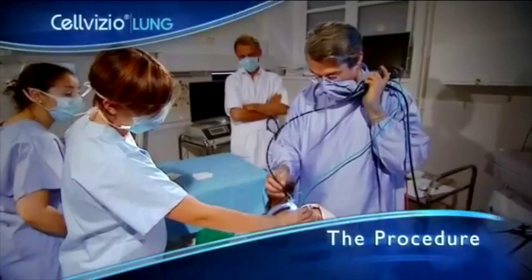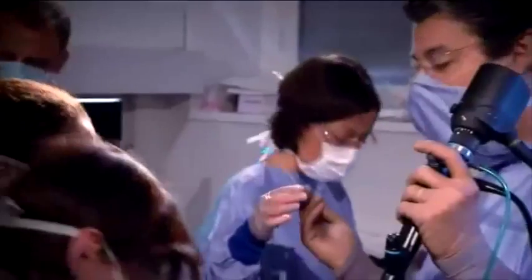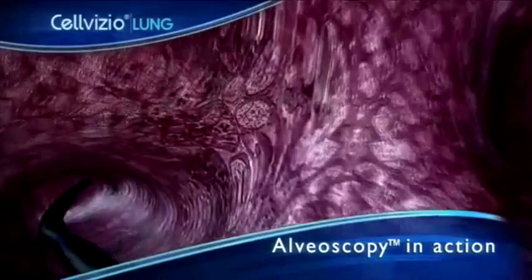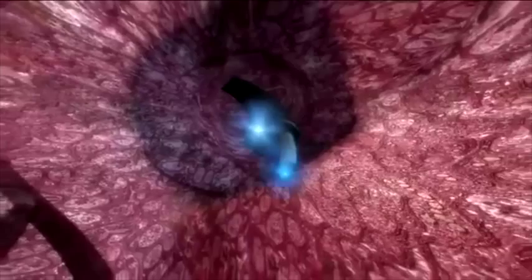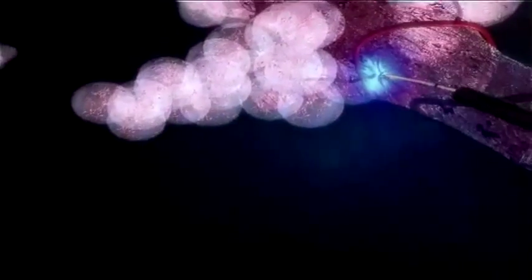The physician performs a standard endoscopy procedure. When the bronchoscope reaches its access limit, the alveoscopy procedure begins. The AlveoFlex is inserted into the operating channel of the bronchoscope and extended further into the terminal bronchi or alveoli. The tip has been graduated for landmarking purposes and to further ensure patient safety. A simple contact between the AlveoFlex and the alveoli to be examined is sufficient to generate real-time microscopic video images.